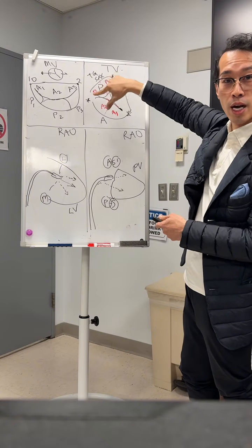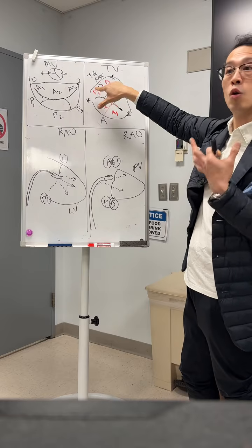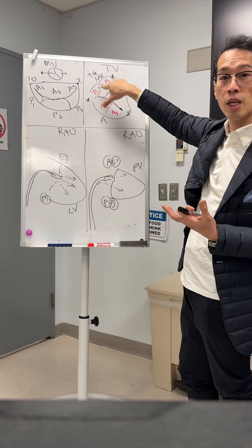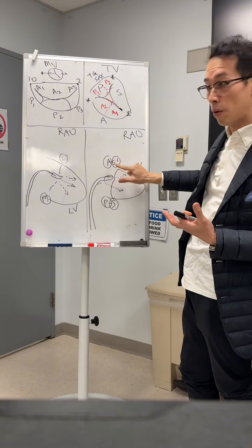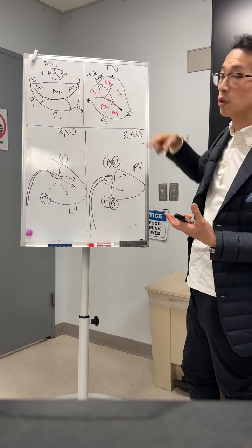You're not at AS or PS. So even though the imager or other people might tell you, oh, you're at the right location, wrong. Because you know fluoroscopically, it's physically and anatomically impossible to have the arm like this in terms of projection. It will always be either this or this, depending on your target, right?